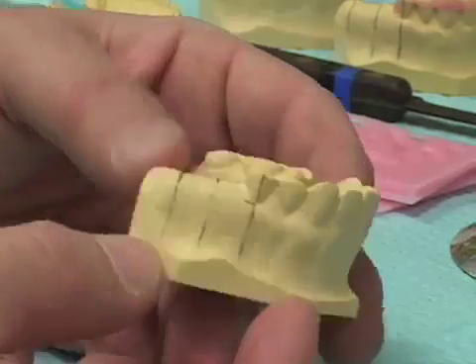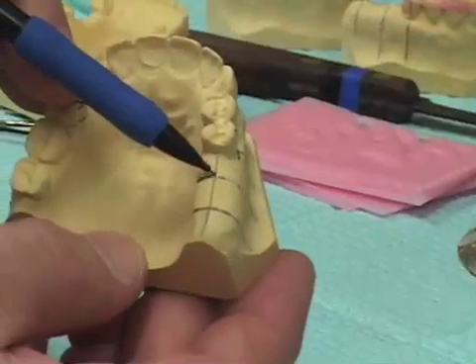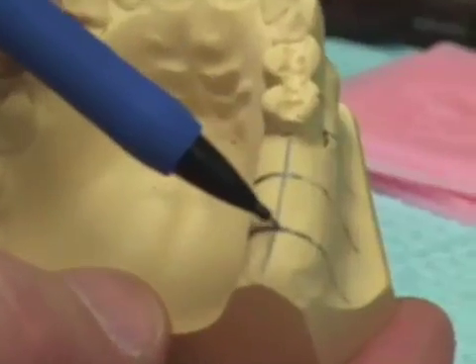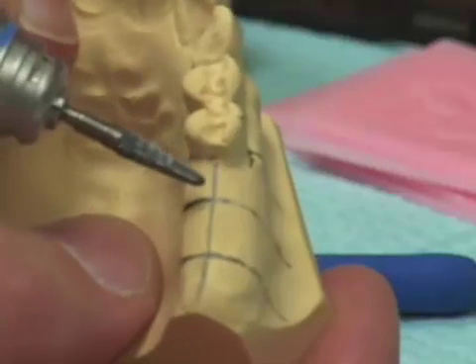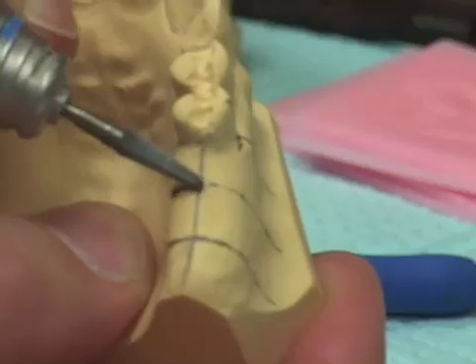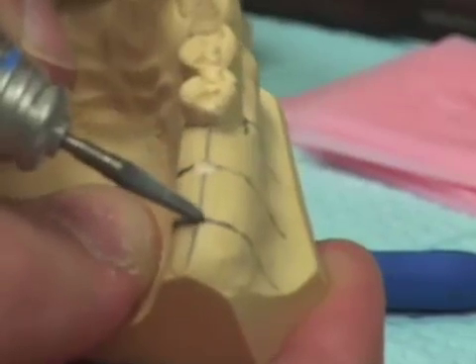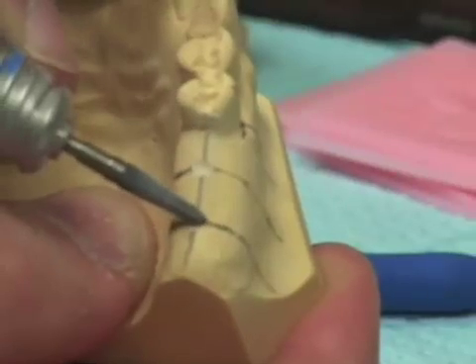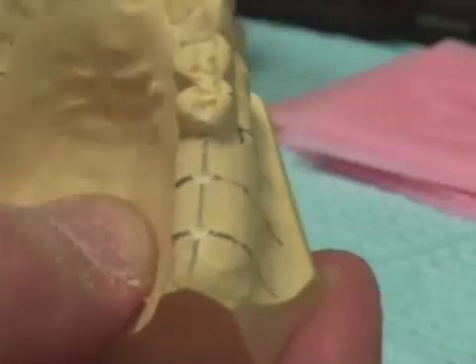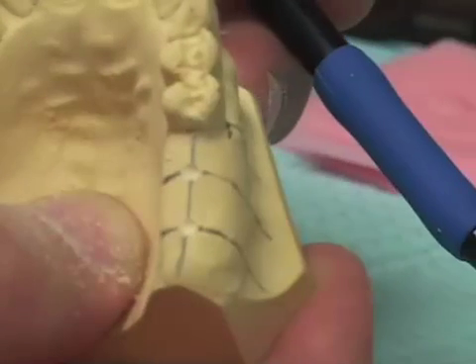Having determined the location for the two implants, I want to take a round bur and make a small depression. I'm coming in with a slow speed handpiece and an acrylic bur, and I make a small depression in the exact location where we propose placing the two implants.